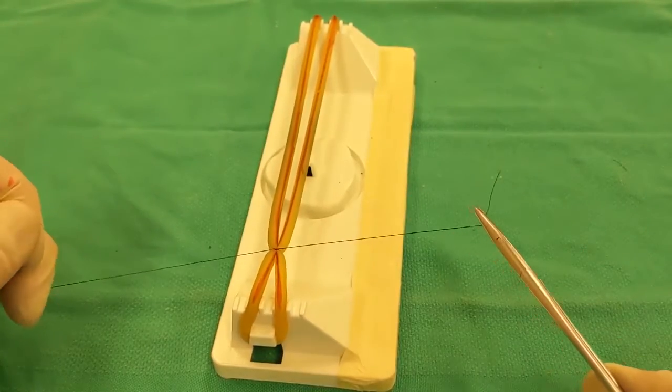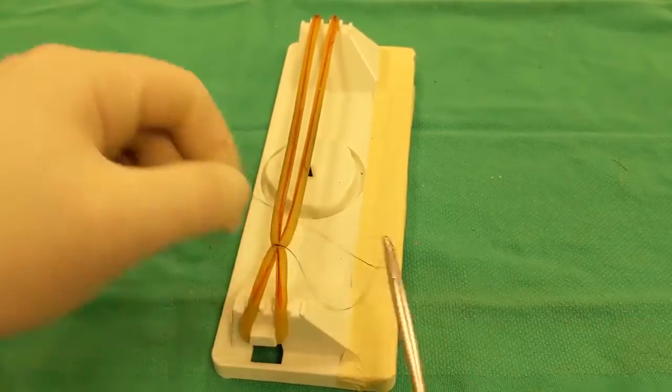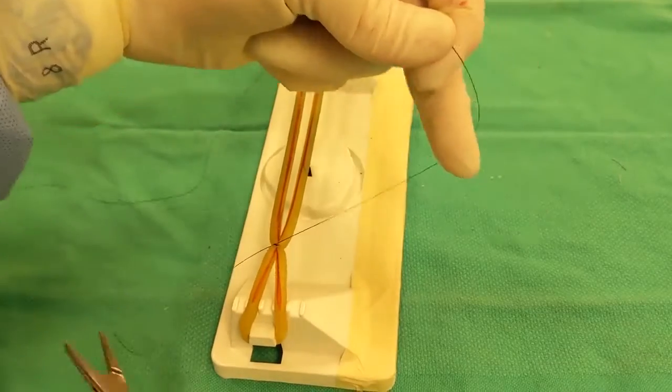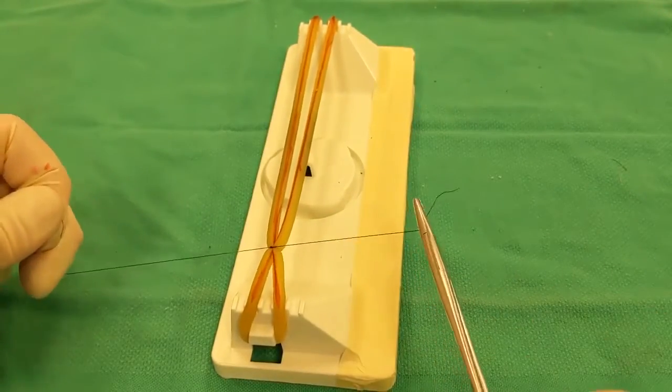You'd like for all the strands to be tidy and parallel. As always, a second square throw locks your first throw, and then you'll place another knot on top to lock your ligature in place.